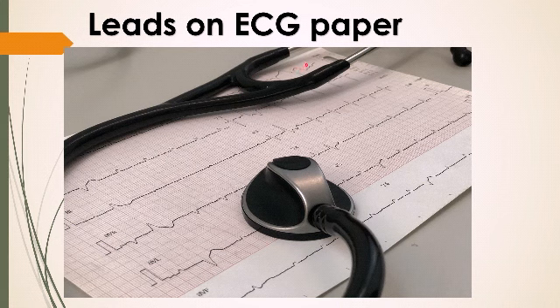There is V1, or first chest lead, V2, V3, V4, V5, and V6. You see, these are the 12 ECG leads.